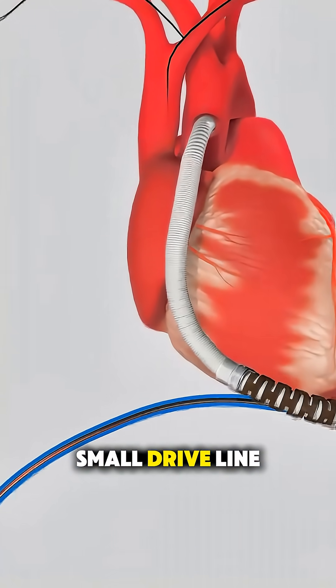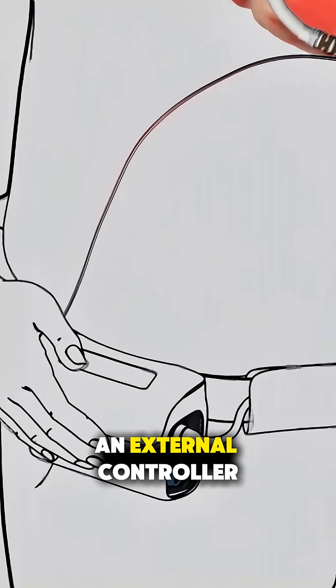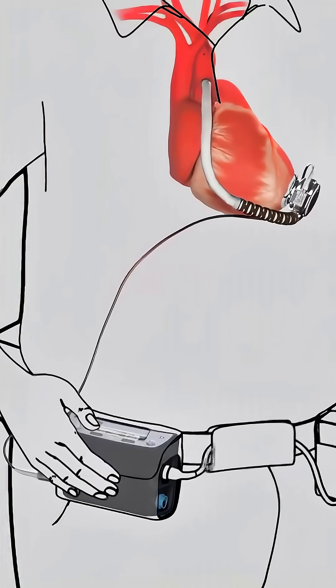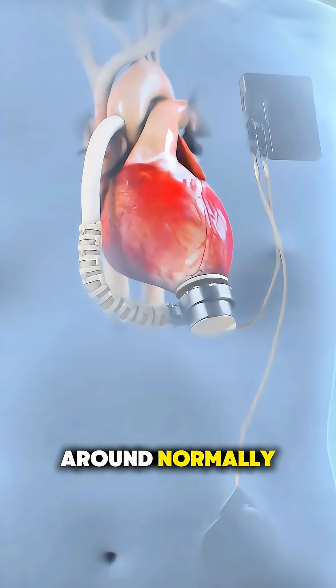The pump is connected to a small driveline cable that exits through the skin and links to an external controller and batteries — basically the system that keeps everything running and allows the patient to move around normally.